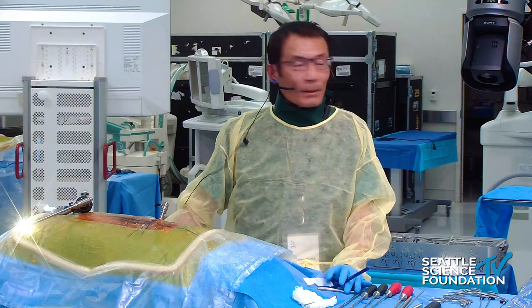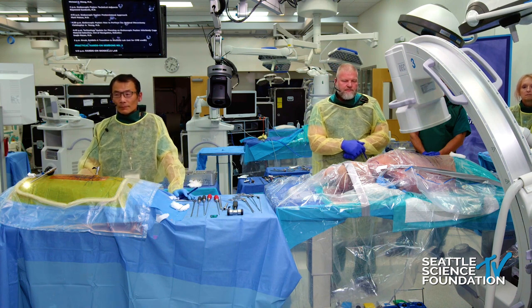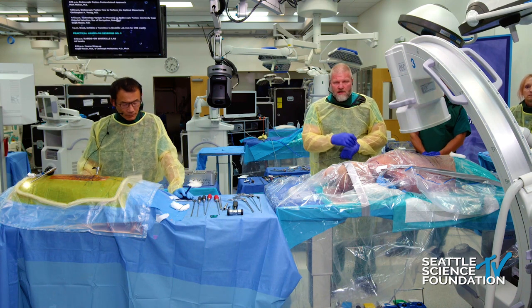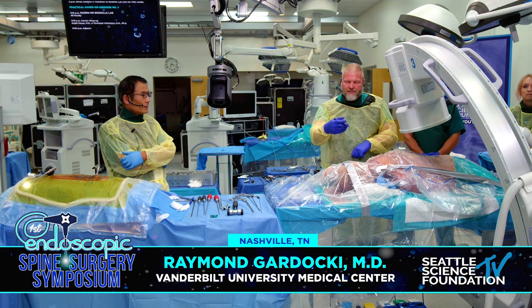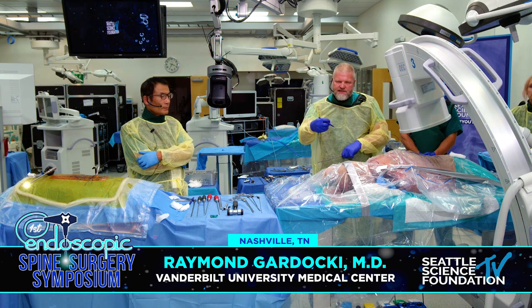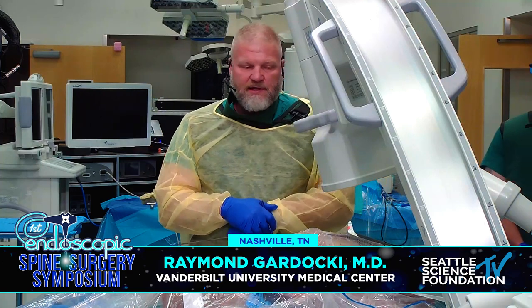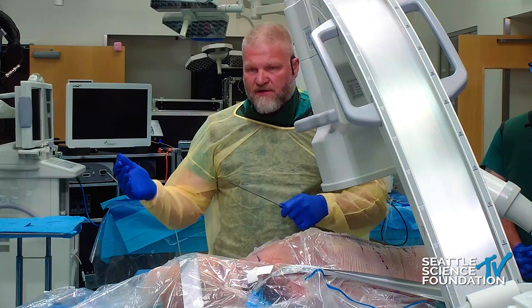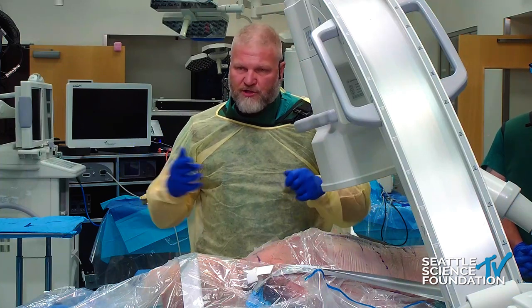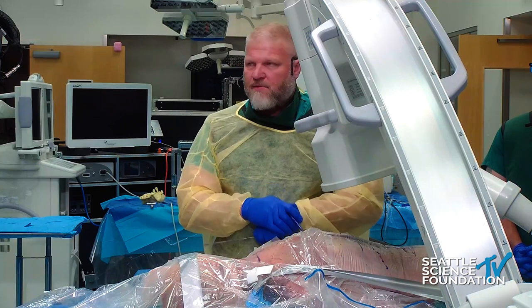And Ray, you want to talk about the transforaminal? Sure. So the transforaminal approach for the fusion is pretty much like the transforaminal approach for a discectomy. I'll show you in my lecture that I like to use the pre-op MRI imaging to plan the trajectory so that you go through the spot you want to decompress, and your implant ends up where you want it to end up. A little harder to do with a cadaver because I don't know the exact size and depth, but we'll take a shot at that. So basically, you want to get into the foramen, do your decompression, identify the most at-risk nerve root, which with a traditional transforaminal fusion is going to be the exiting root. You want to protect that root, and then you want to do your discectomy and put your implant in.